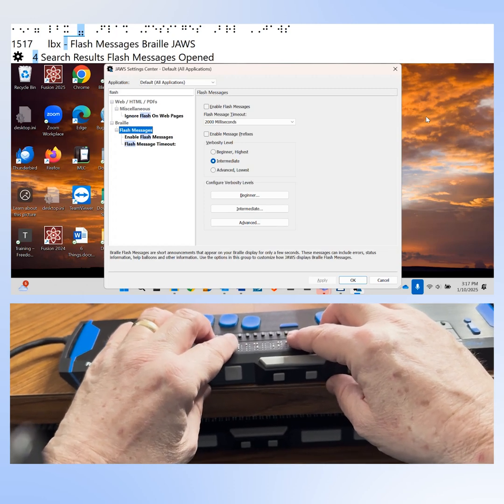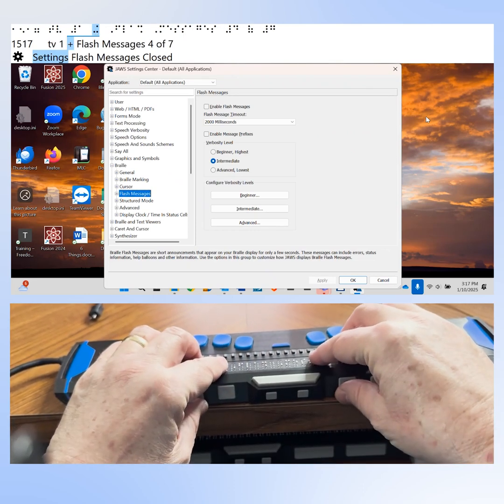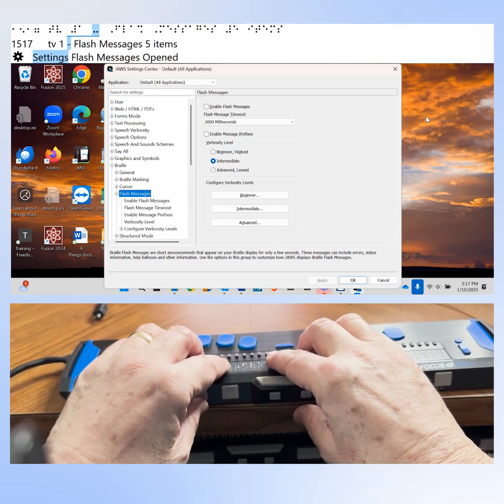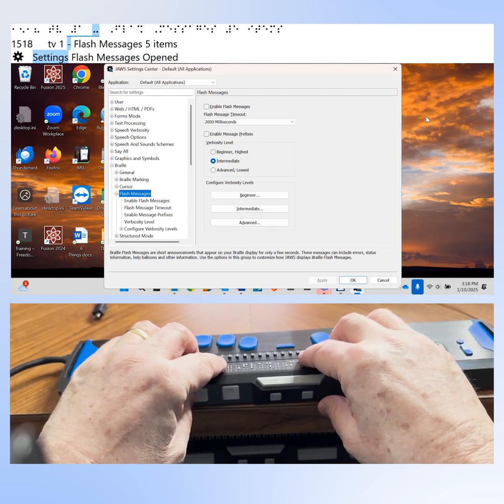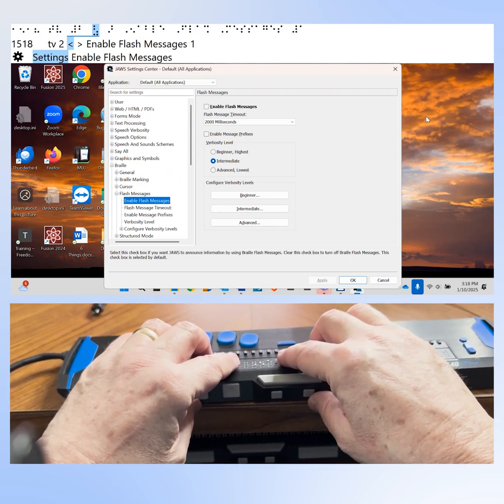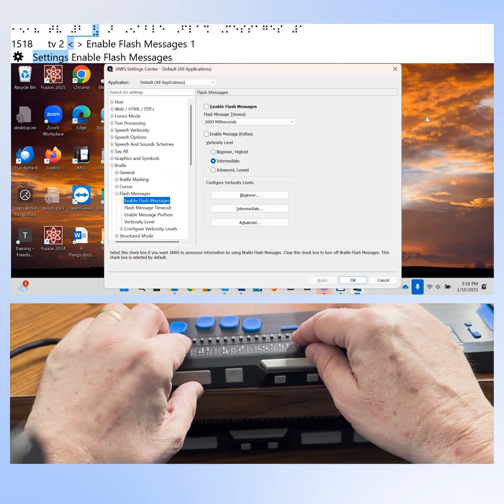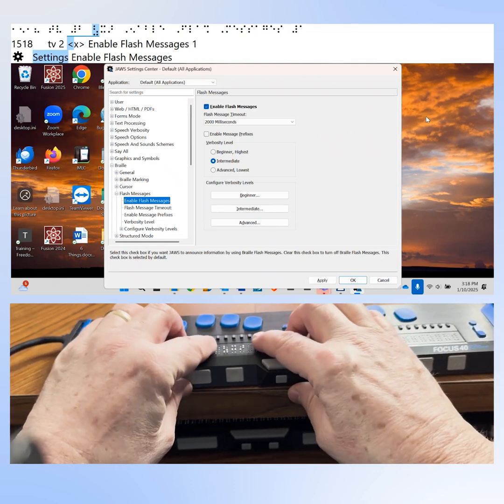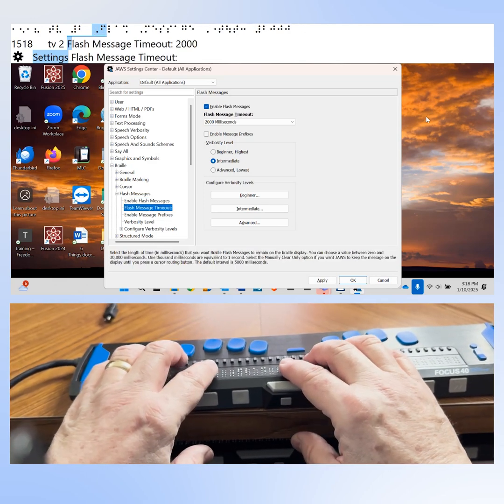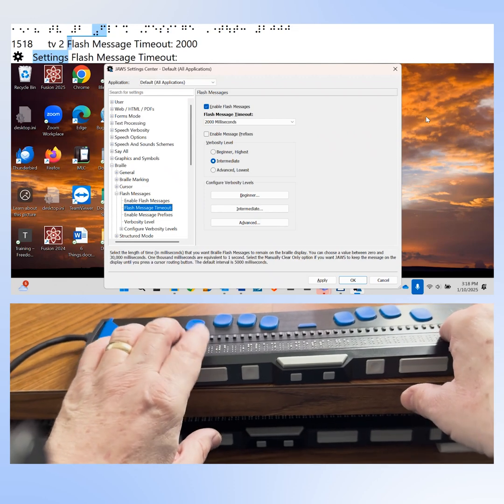Press down arrow to reach "Enable flash messages," which is currently not checked because I disabled it in the previous section. Let's press the space bar to re-enable flash messages. Arrow down once more to reach "Flash message timeout," currently set to 2000 milliseconds. Flash message timeout defines how long the flash message appears on your braille display. I've got mine set for 2000 milliseconds, which is the same as two seconds.